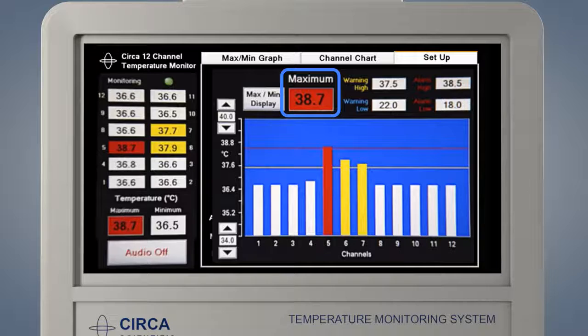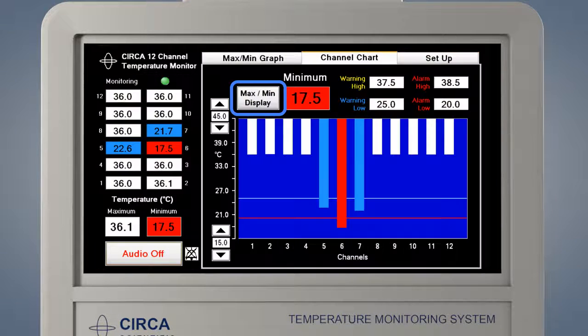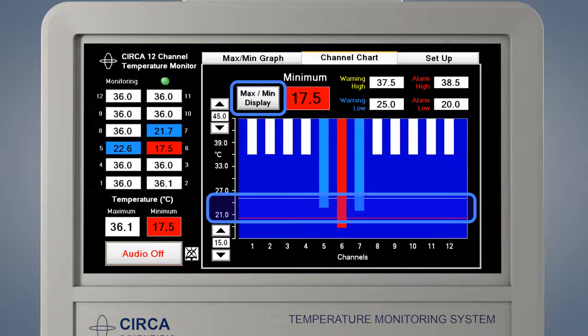The maximum or minimum temperature is displayed in the large box above the graph — this box will display the hottest or the coldest temperature. The max-min display button allows you to switch the screen between maximum and minimum depending on the type of procedure being done. If the word 'maximum' is displayed, the graph will display the high warning and alarm limits and the highest temperature — this is used for heat-based procedures. Press the max-min display button to change the orientation for a procedure in which the temperature is expected to get colder; the word 'minimum' will be displayed and the coldest temperature shown. The chart will display the low warning and alarms with a blue and red line — this is used for cold-based procedures.